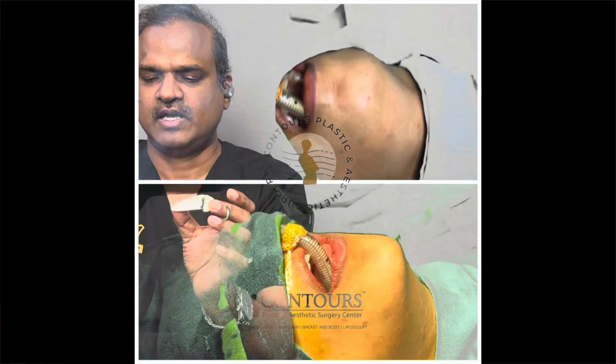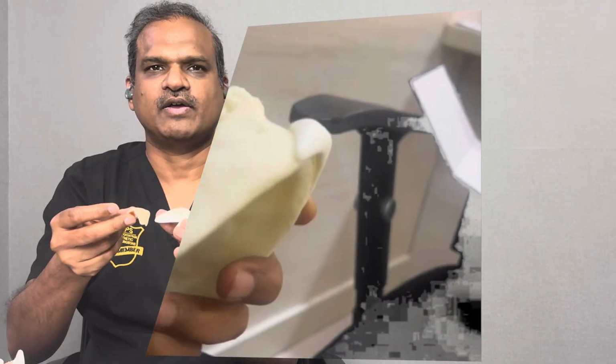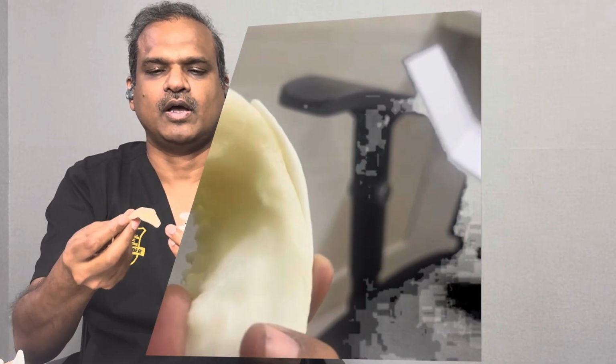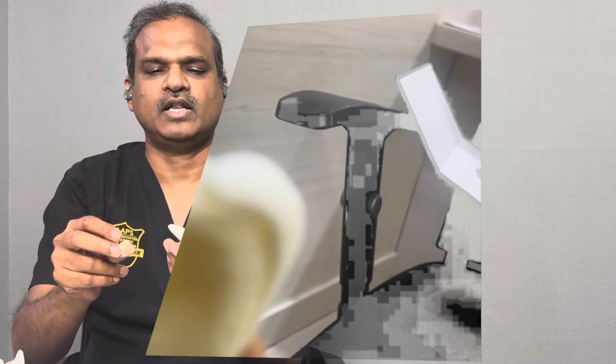How do we fix this to the jaw? Let me show you another example. Similar one you can see. This is another lower jaw reproduced with this again. This is the implant. See, this implant is bigger than the other one. So everybody will have a different jaw, everybody will have different beauty measurements and desires. If we want a bigger one, this can be done.